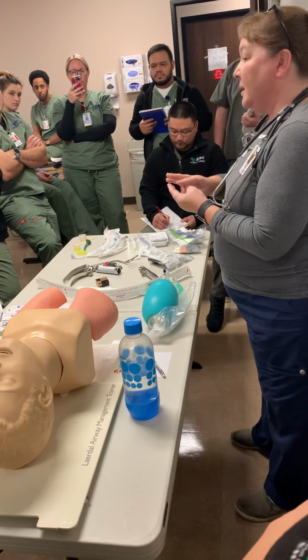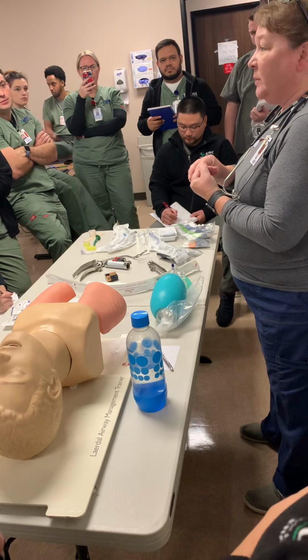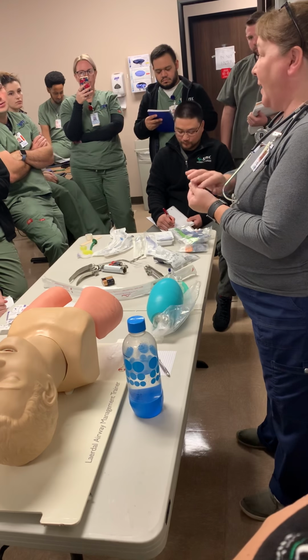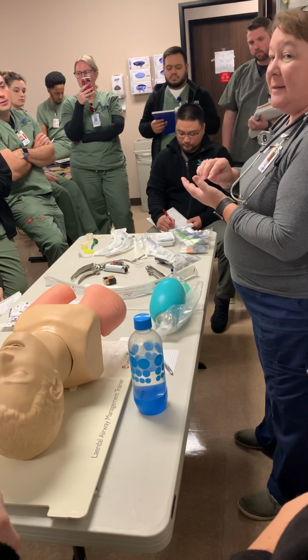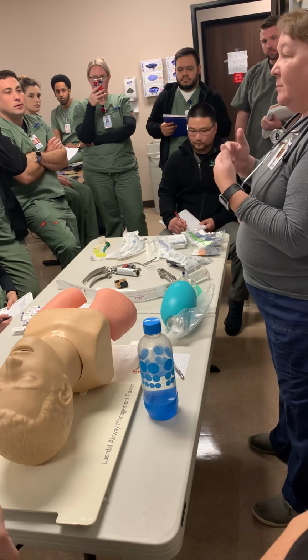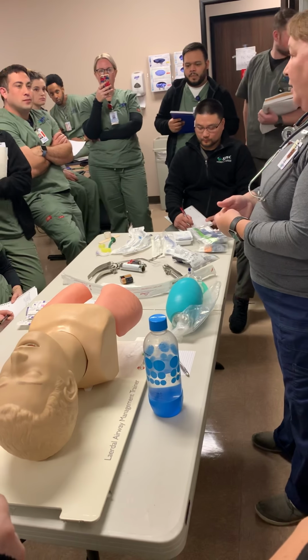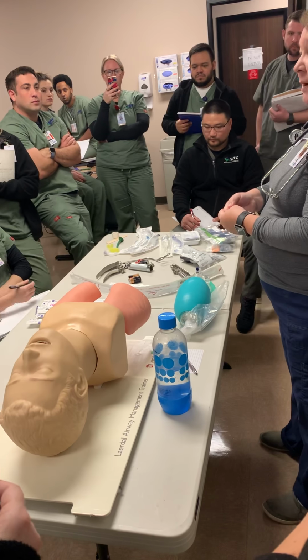So four reasons. Everything but inability to protect the airway would be automatically followed by a ventilator, but today we're just talking about actual intubation. Just because someone can't protect their airway doesn't necessarily mean that they need a ventilator as well. We don't see it much anymore, but it is important to understand that you could just intubate someone because they can't protect their airway, but they're still able to breathe. So they don't necessarily need to go on a vent.